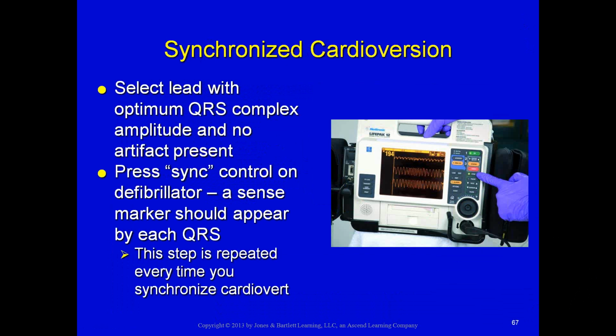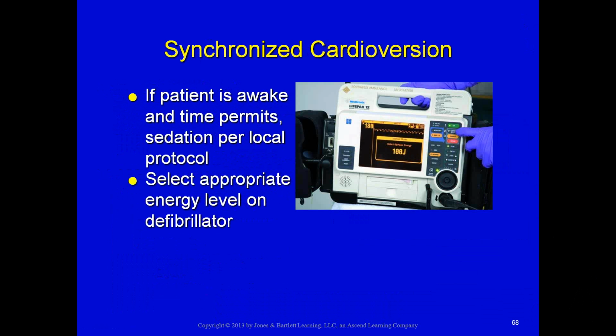When we synchronize cardiovert, we're synchronizing the shock. So you press the sync button, it marks the QRS, that's how you know it's on and working. Once you synchronize cardiovert somebody, that sync goes off, and you have to turn it back on each and every time.